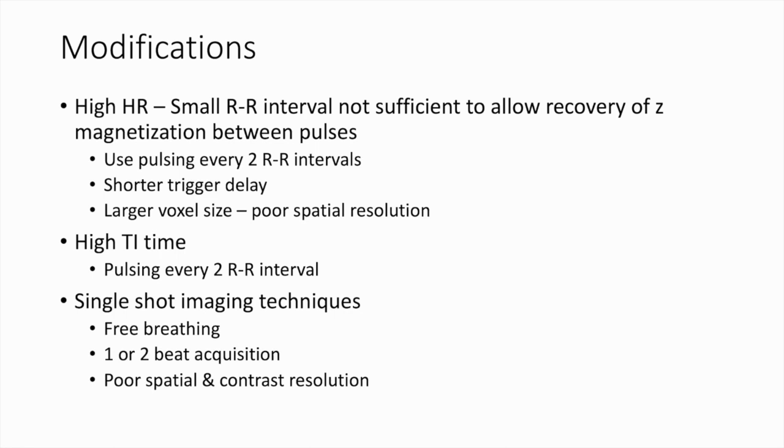Single shot delayed enhancement techniques can also be used in uncooperative patients with free breathing. It can be acquired in 1 or 2 beats, but the spatial and contrast resolution will be poor.